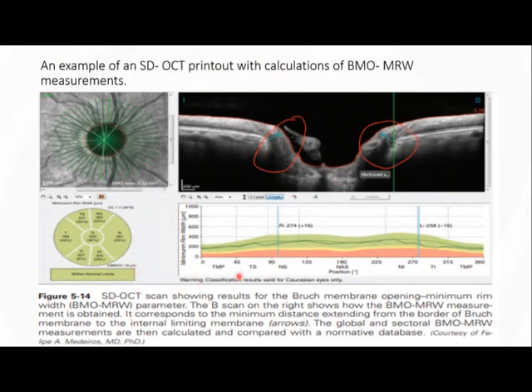So those green arrows, sir, this OCT, sir. That OCT is okay. This is the dark line which is showing like this. Yeah. Okay, sir.